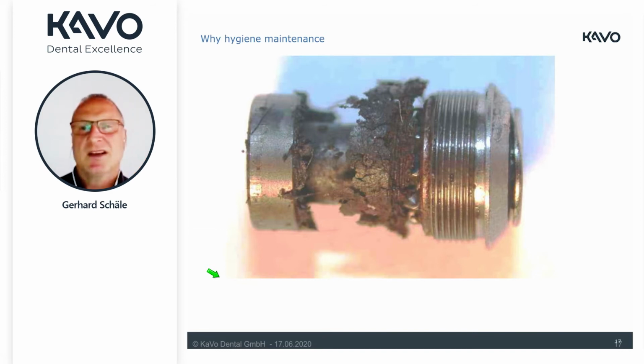The important point is that these particles will stay inside and be baked in by the heat. That means we heat up the instrument up to 135 degrees. When we do this several times, you will have one layer after the other built up in the instrument, and no cleaning procedure can clean an instrument like this.